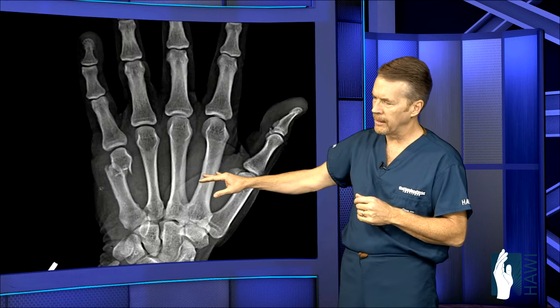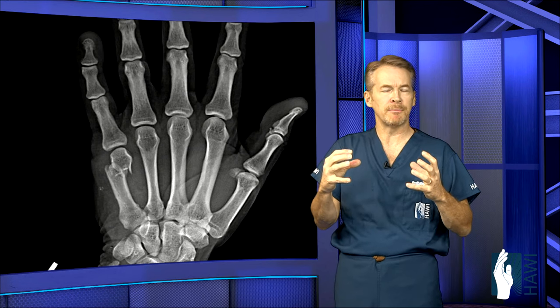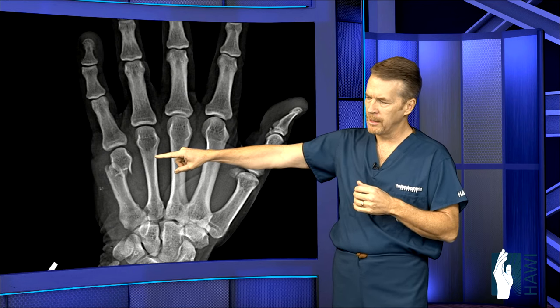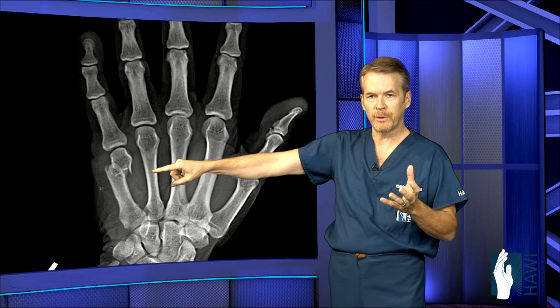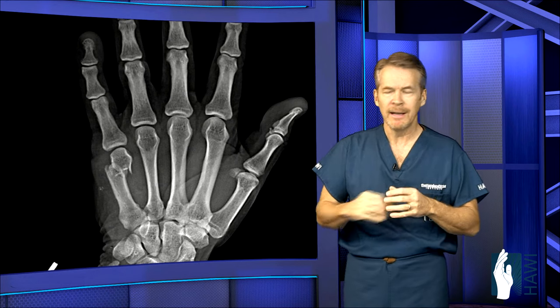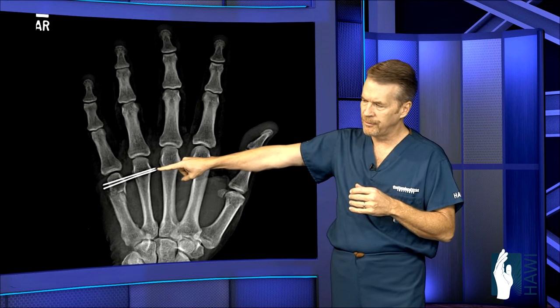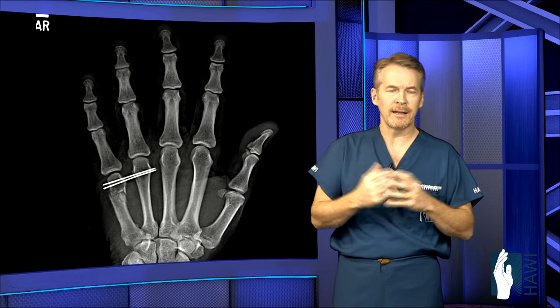We talked earlier about boxer's fractures, where we typically accept a lot of angulation. But one time we do fix them is when the bone is completely separated — look at the shifting of the head relative to the shaft, completely knocked off. In this individual, we put it back in place without cutting open, then shot a couple pins across — two pins going across the fifth metacarpal head into the fourth metacarpal head, anchoring it back in place. Then the pins come out and rehab follows.